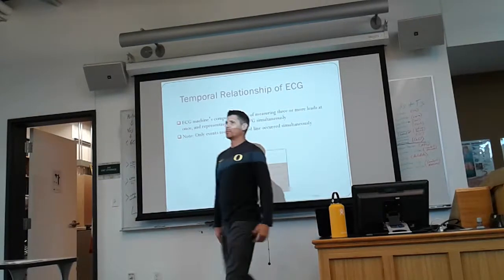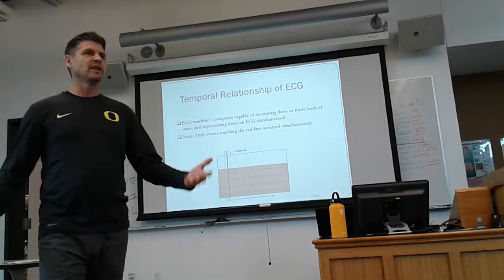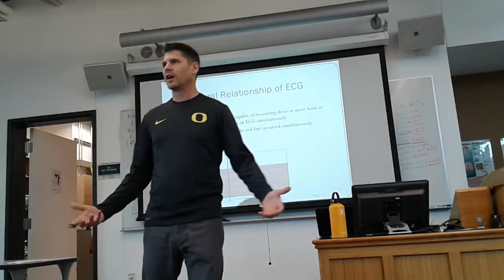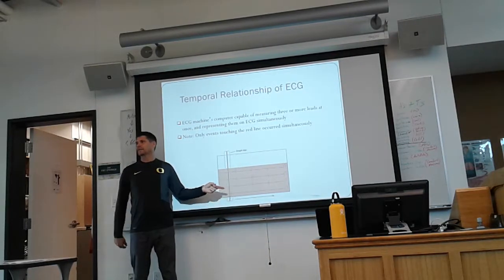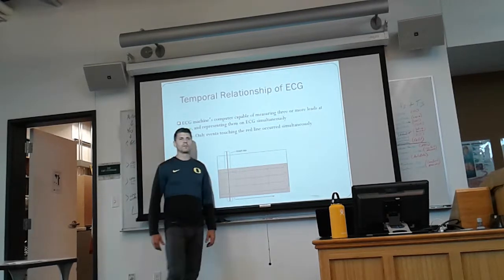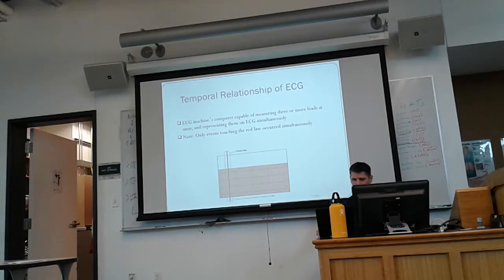This is, by the way, the benefit of the 12 lead. Because sometimes you're going to look at a single lead and think, I can't see what's going on here. I don't know what's going on. So you just look at another lead. Another lead will show you what's happening at that exact same time, no matter what. So it's just a matter of being able to see it that way. Good.